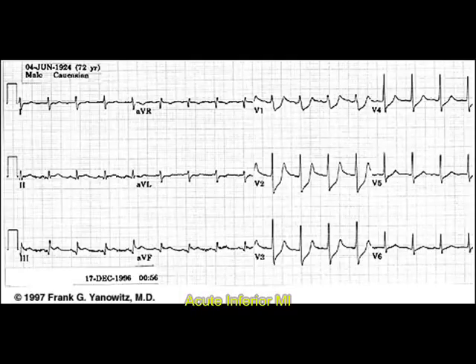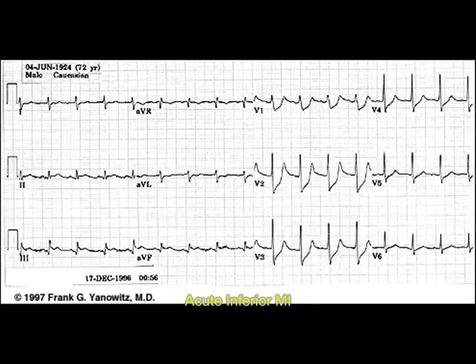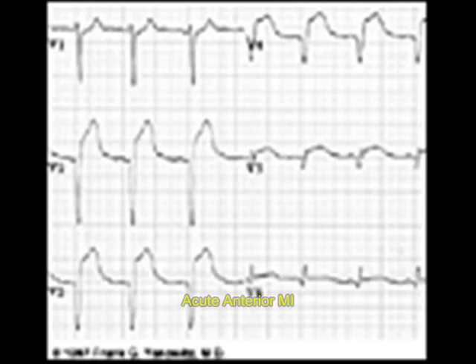Now you can see ST segment elevation in leads 2, 3, and aVF. This is characteristic of inferior myocardial infarction. Leads 2, 3, and aVF will have ST segment elevation, and there will be depression in V2, V3, V4 — those are reciprocal changes.